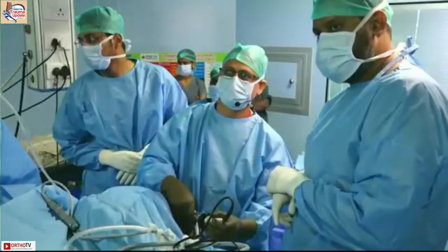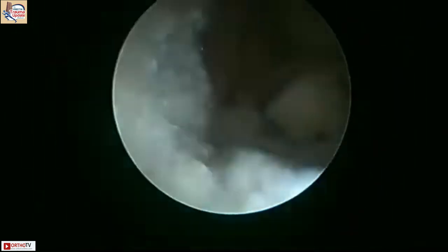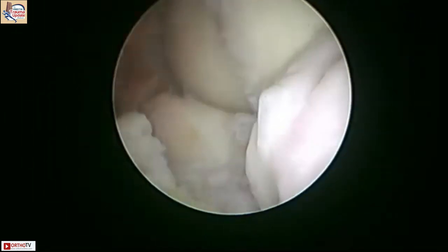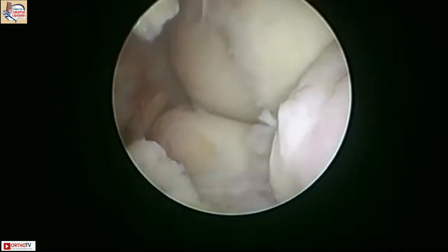Okay, so we're back in. Camera is turned around. Okay, so we'll show you a little bit now. So we've removed the body, see? It's off. So that is the coronoid. Give me a second, I'll show you the coronoid.